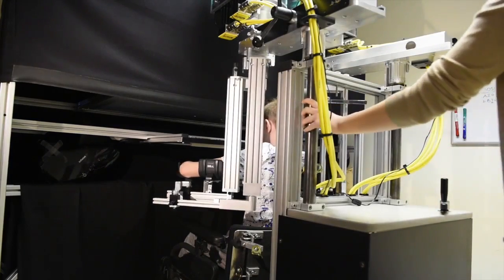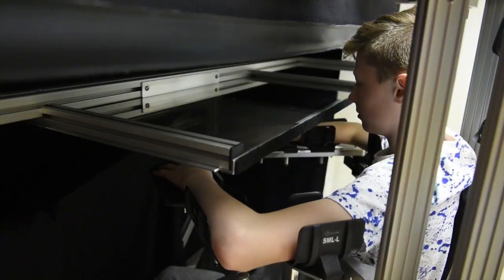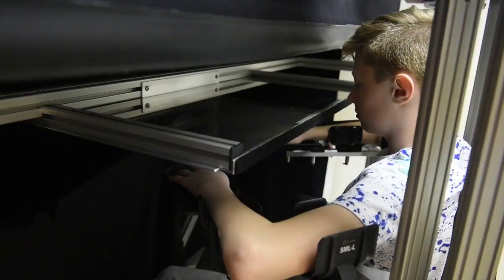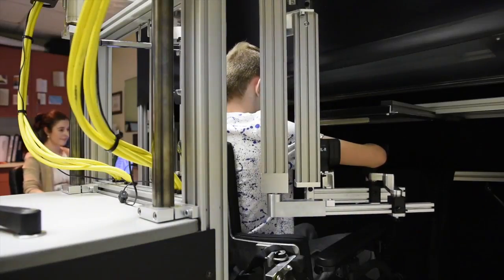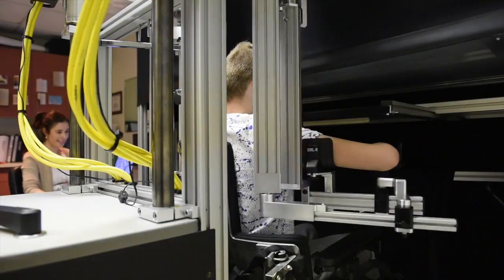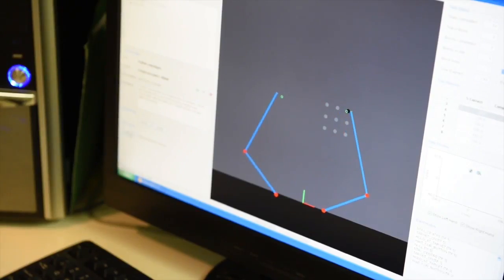So our sensation of movement, that's called proprioception or position sense, because the brain needs to know where your arm is in space if it's going to be able to make it work normally. And so we've been using the robot to study position sense in particular, as well as some other types of sensation and movement in children who've had a stroke around birth.